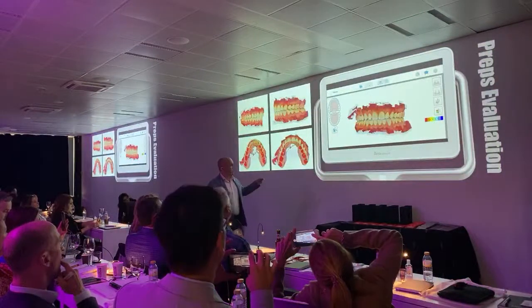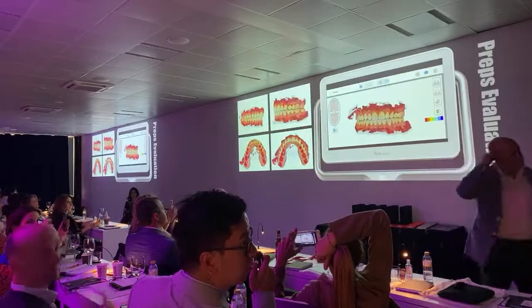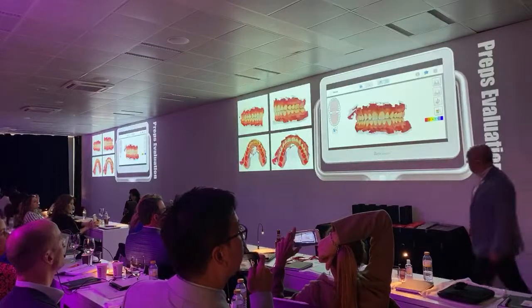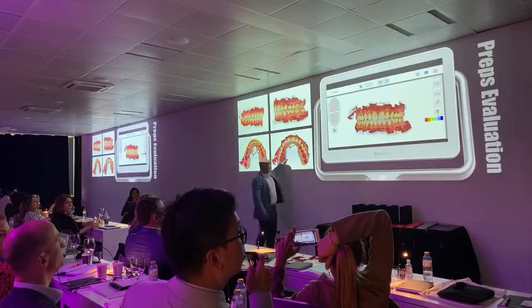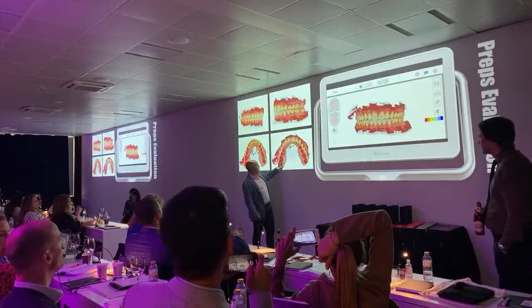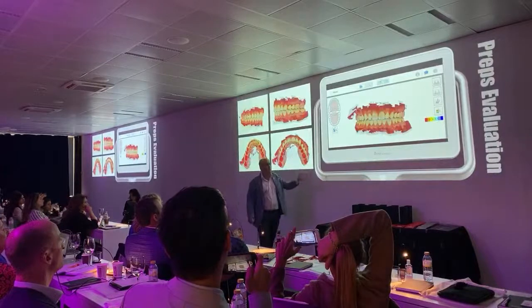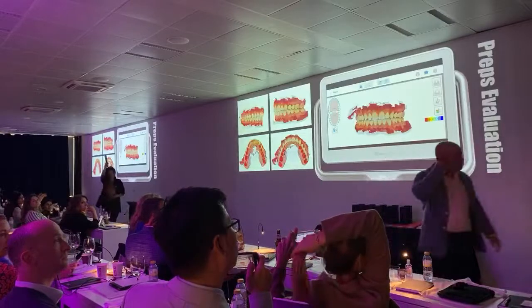These are the slides from iTero. Let's go. Where's Jackie? Jackie's ready. So now, 2 slides, right? Now comes the icing on the cake. Actually, I'm demonstrating. This is the insertion axis. So you can see if you have any red areas. This is specifically from iTero, right? Yes, in iTero, you have to move your STL.